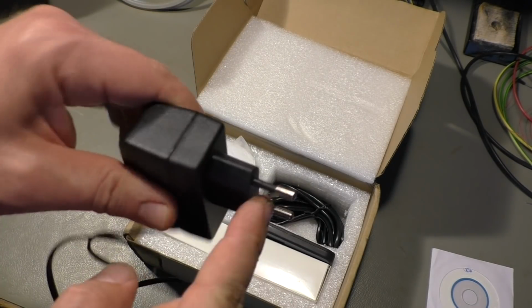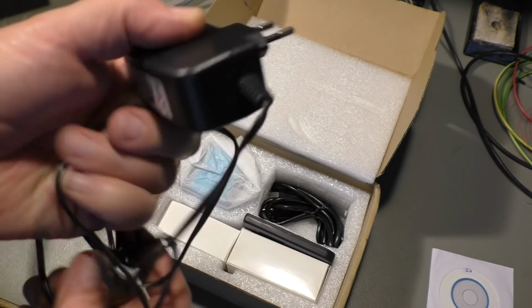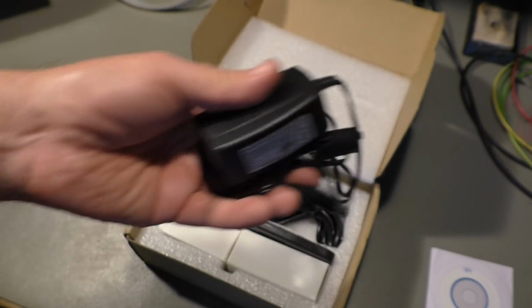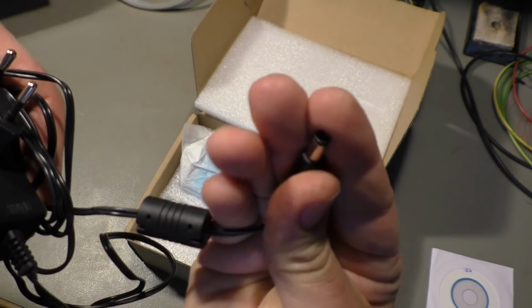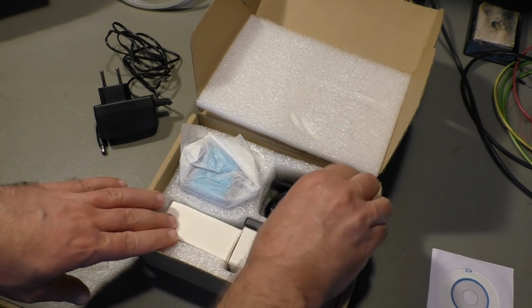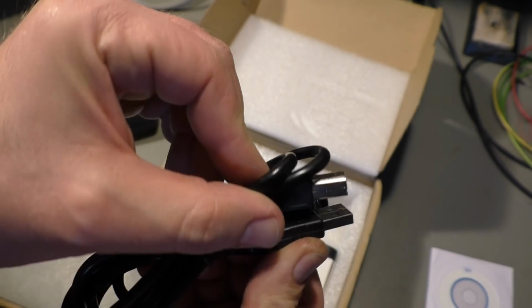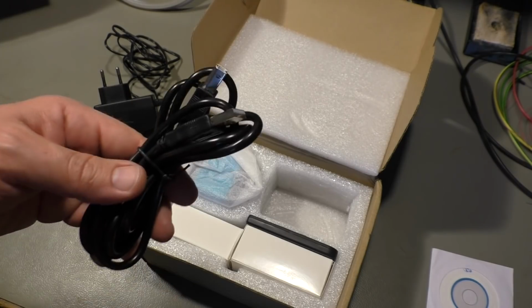I already changed that for a European version. It was an American plug. Doesn't help me a lot. It's 12 volt and 1 amp. So any 12 volt 1 amp power supply with a plug like this one will work. Then we get a chunky USB cable with a USB A and B type plug. You can also power the camera with that one.